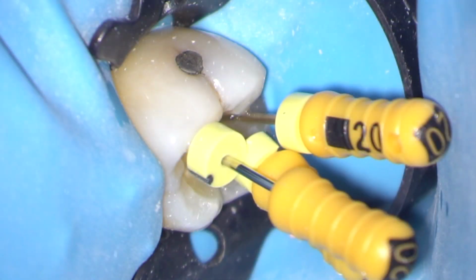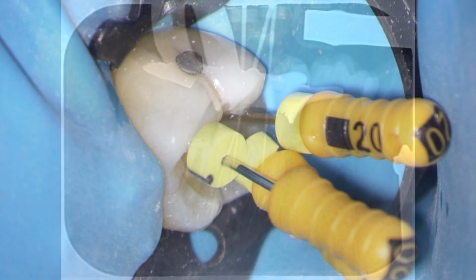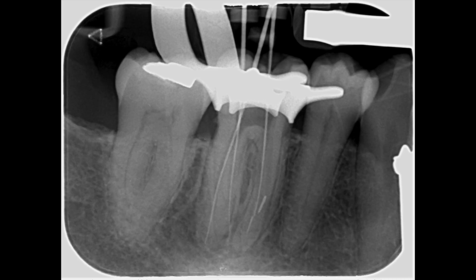Before finishing preparation with a primary instrument, I took a diagnostic working length radiograph using size 20 files. You can see that I've managed to bypass the most apical piece of fractured instrument in the mesial canals. This would be almost impossible to retrieve. You certainly wouldn't be able to see it with the microscope.